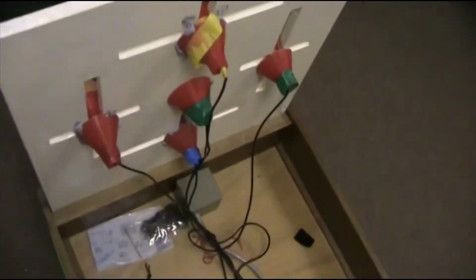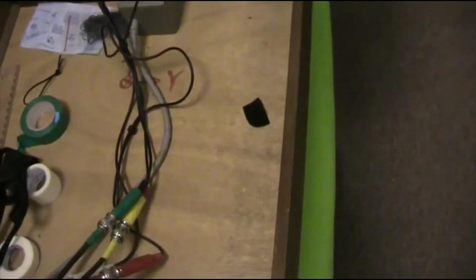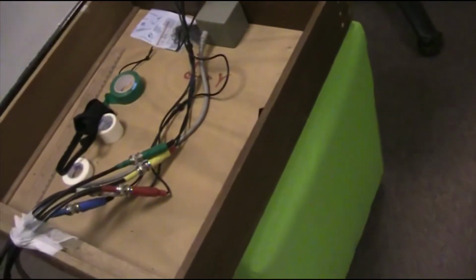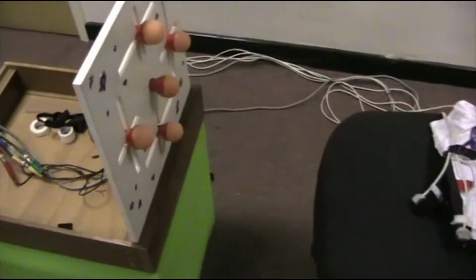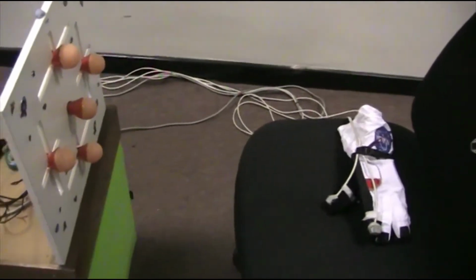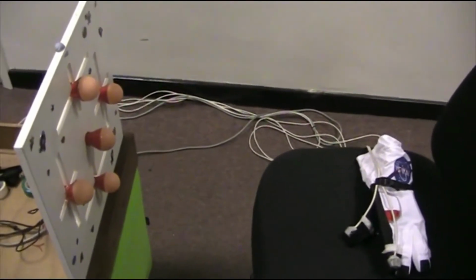It's really important for your experimental setup to have no metal or minimal metal, in particular iron or electrically conductive devices or radio frequencies or radioactive things, especially in the experimental area. So the chair, the table, the participants, they all need to have as much metal removed as possible. And it's a bit like a brain scanner in that sense. So you might ask your subjects and yourself to remove keys, coins, badges, mobile phones for sure, credit cards, anything which might be magnetic or magnetically sensitive, remove it from the experiment.